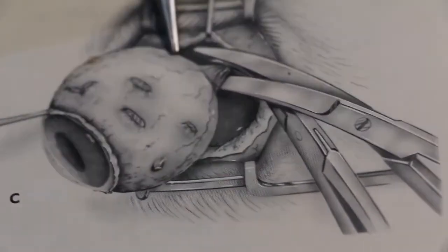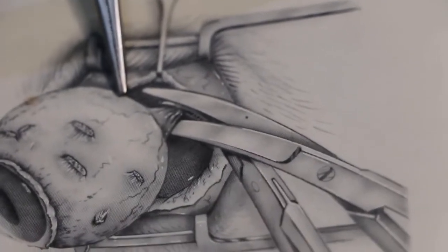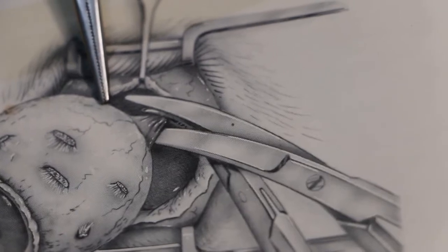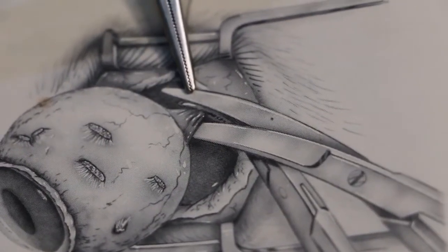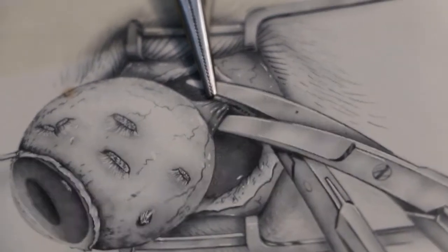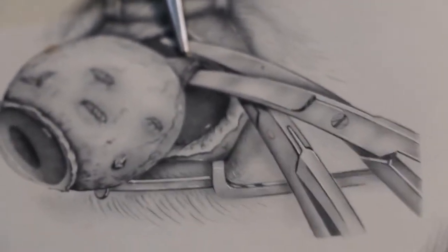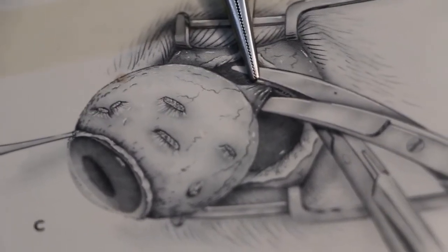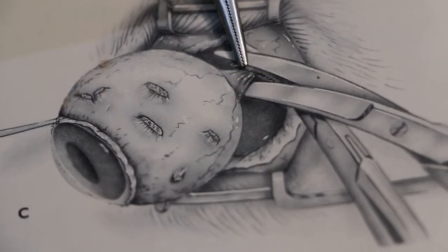Now in this drawing you can see that scissors were used to cut the optic nerve and blood vessels, but I ligate the optic nerve. I ligate it underneath. I don't use the scissors or forceps, so I ligate it, so that it will stop all the bleeding when I cut off the eyeball at the optic nerve area above the ligation.